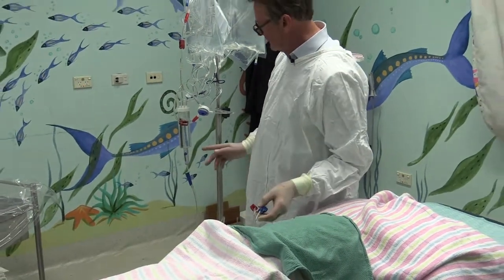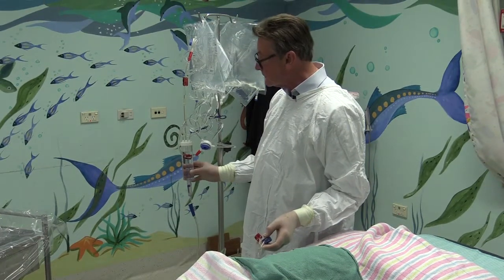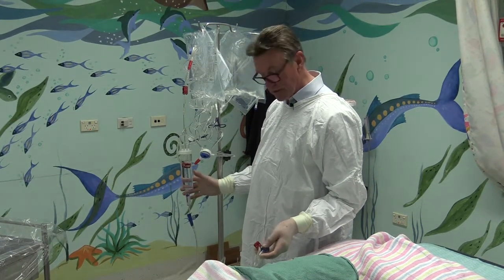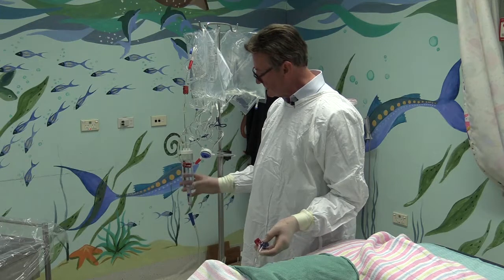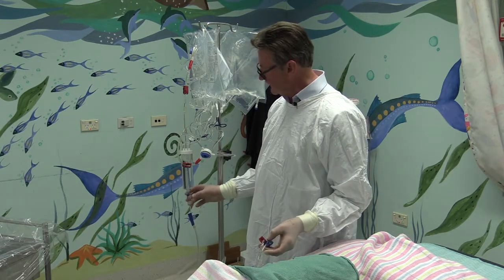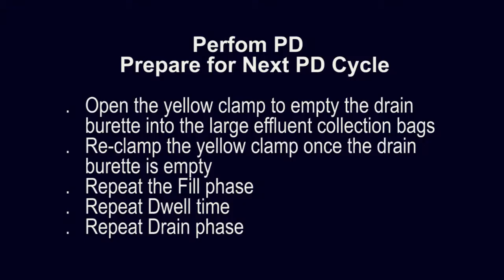The administration set can remain on the patient for the duration of the treatment, changed if they have peritonitis. Since this was put together under aseptic control, it can remain on the patient unless there's a contamination of the circuit.